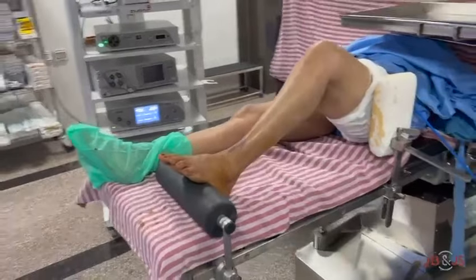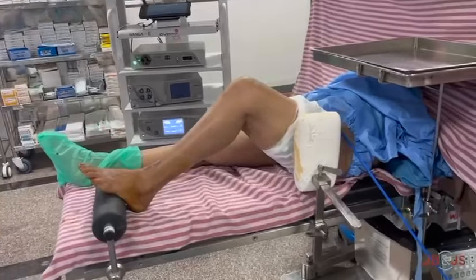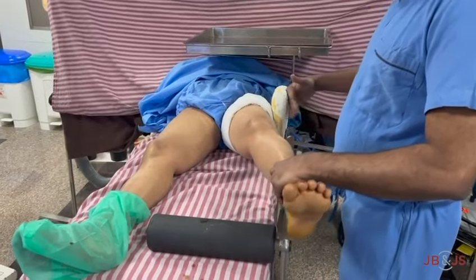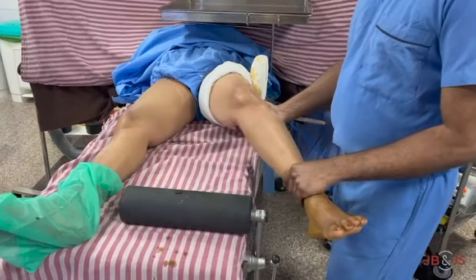The patient is positioned supine with a lateral thigh support against a tourniquet and the foot supported on a leg holder that maintains the knee in 90 degrees of flexion. The assistant can then apply valgus stress to open up the affected medial compartment using the lateral thigh support as a counterforce.